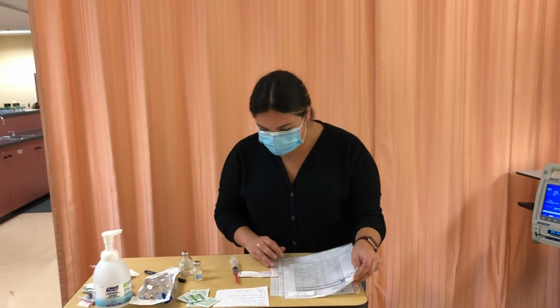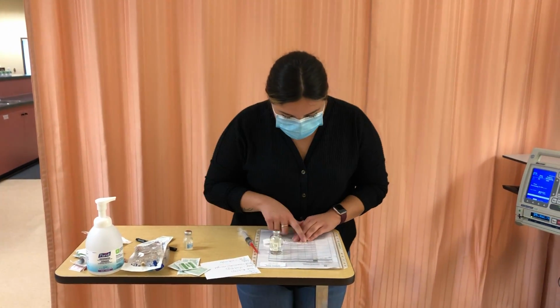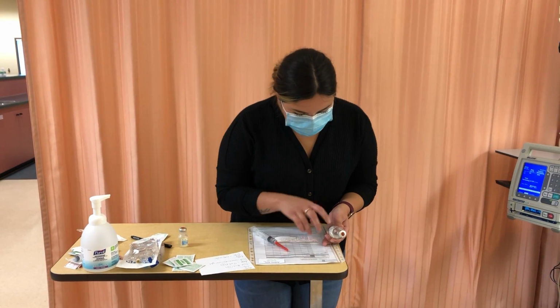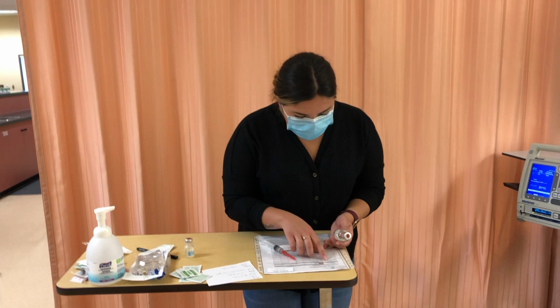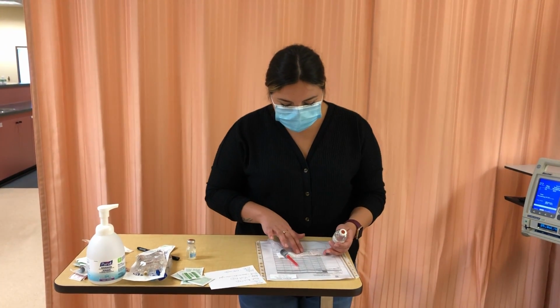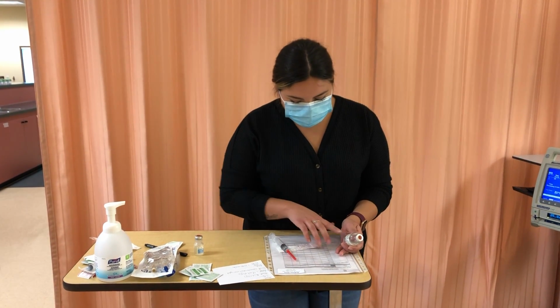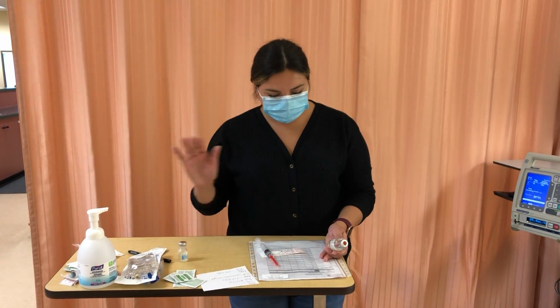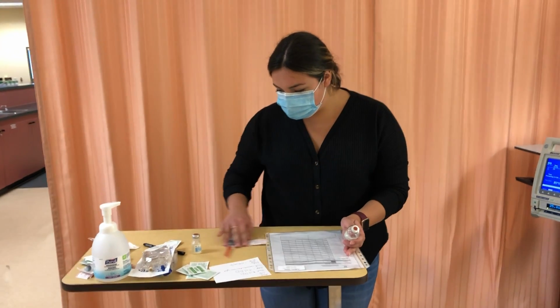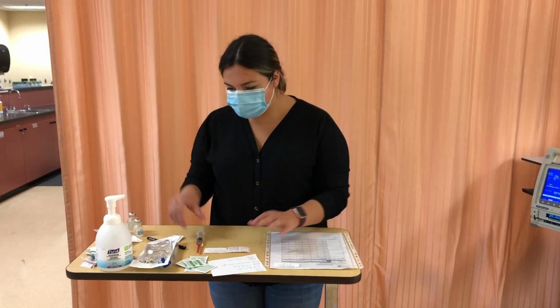So I'm going to go ahead and do my second check before I dilute. So I have Emma Wrightson, no known allergies. She's getting cloxacillin, 1 gram. This is a 2 gram vial, so I've taken 1 gram of medication in 4 milliliters of solution as I've done my calculations. This is to be given IV. It's for IV use only, and I'm going to dilute this in an IV mini bag. It is due every 6 hours, and the next dose is due now, so I'm okay with administering this medication. I would discard those. So now I'm going to dilute in the mini bag.